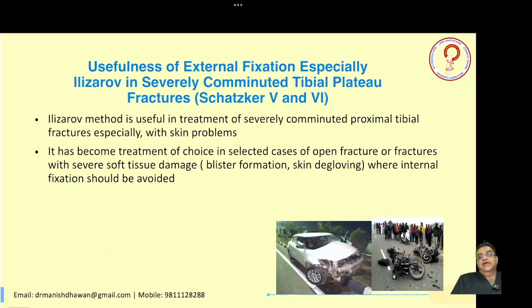Now, Ilizarov method is a very useful modality in severe comminuted proximal tibial fracture, especially with skin problem. It has become a treatment of choice in selected cases of open fractures or fracture with severe soft tissue damage like blister formation, skin degloving, where internal fixation should be avoided. So this fracture basically occurs in a very high velocity car or motorbike accident. So it is very common in younger age group.